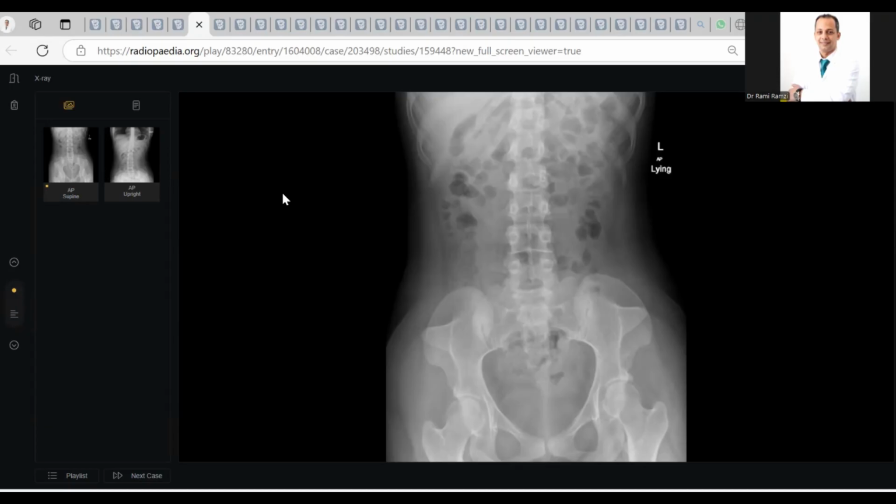Excellent, doctor. You did very well. I give you 7.5 in the last case. This is a nail patella syndrome, and this is an observation film. Take care, my colleagues.